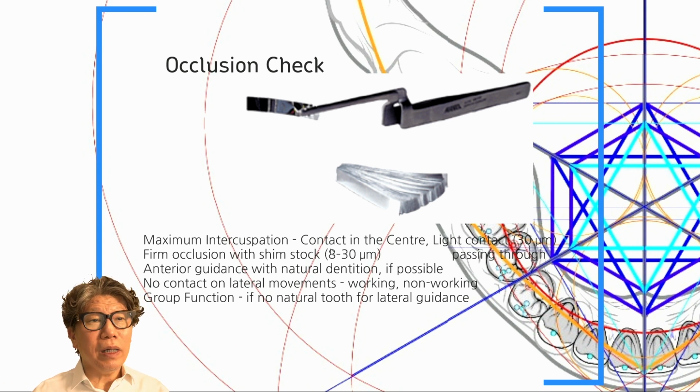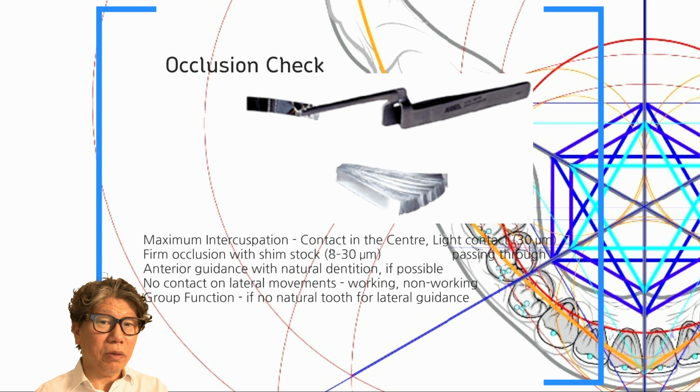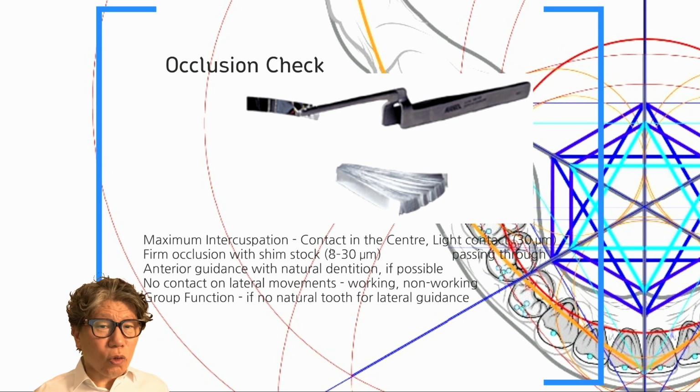If you continue to hypothesize about the reaction of such occlusion from the data, you may realize some things yourself, or the patient may give some signs or responses. When you talk to the patient, you can find out whether it was strong or weak. Patients are also diverse. There are people who are okay with a high level, those who cannot stand it even if it's slightly high, those who can quickly notice even a slight decrease, and those who are fine even when it's low. There is not just one correct answer.